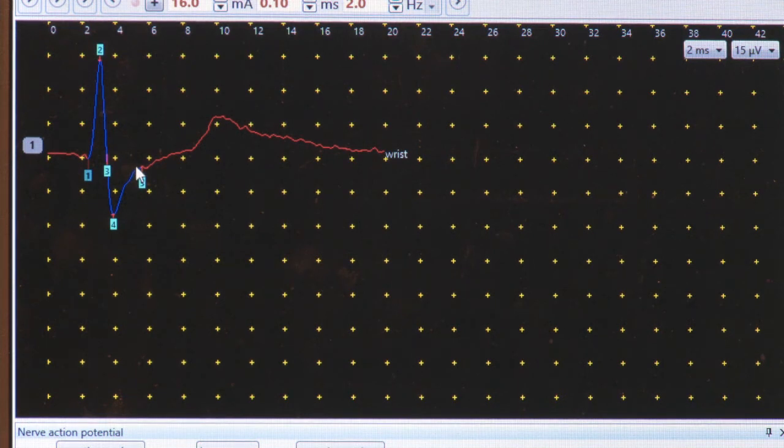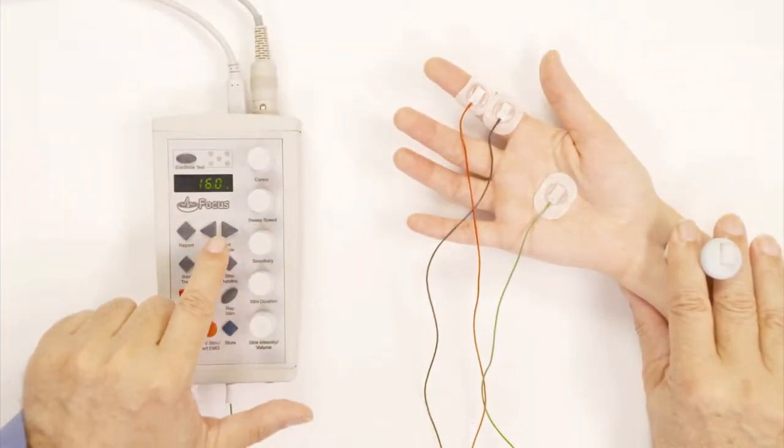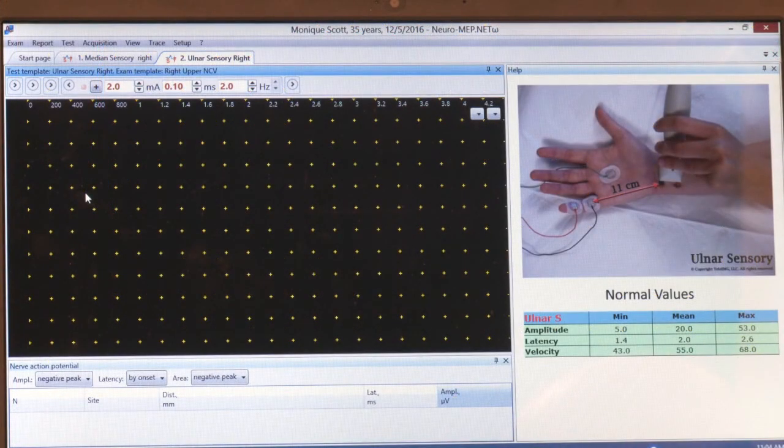So now I accept that. And in order to go to the next nerve, I press the next here. And you will see that the ulnar sensory comes.